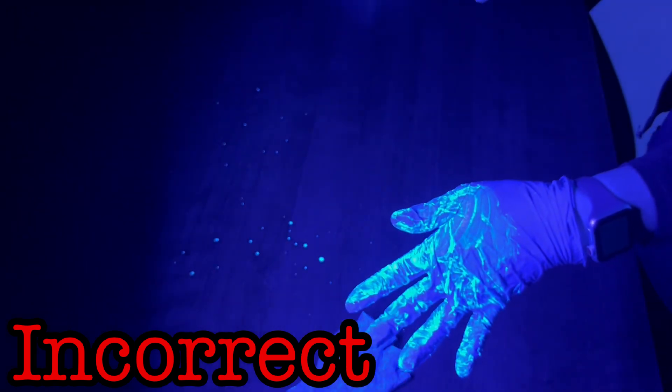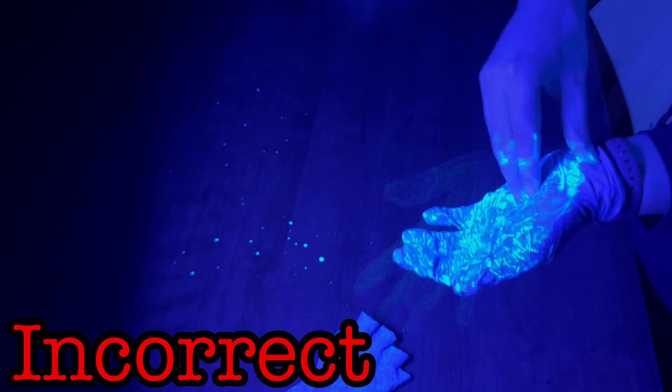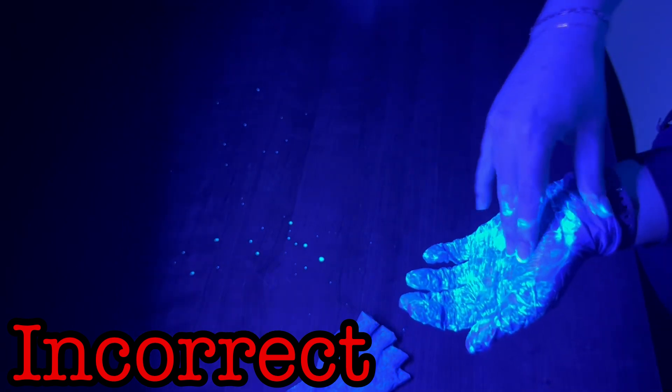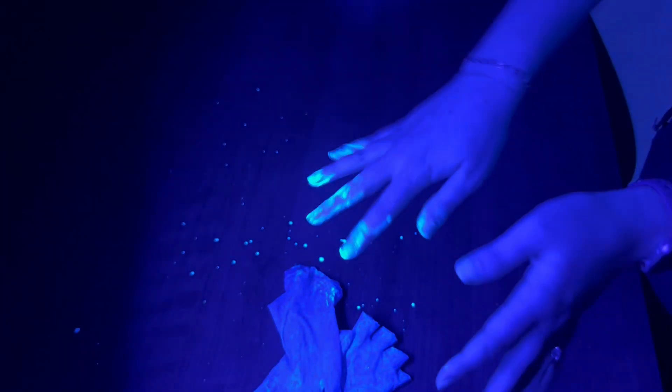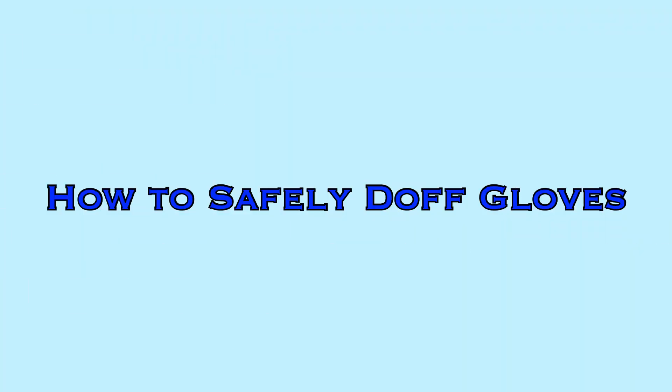In this example, the gloves are quickly ripped off from the first hand, which causes the contaminant to be flung from the gloves and come to rest on the table. And because the second glove is then removed by the ungloved hand grasping from the outer surface of the glove, contaminant is spread to the fingers and palm and wrist of the first hand. These issues can be avoided by utilizing proper technique and just being a little bit more careful.